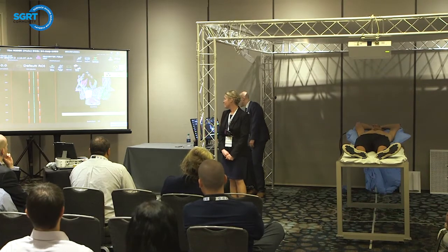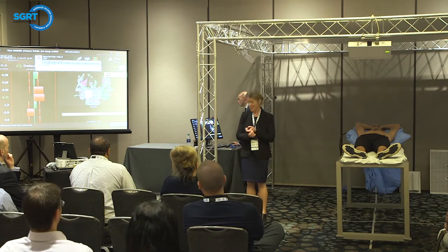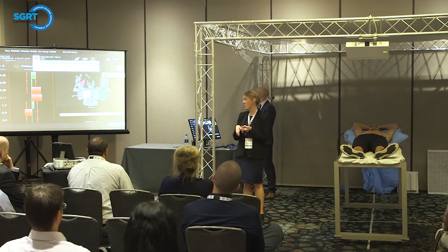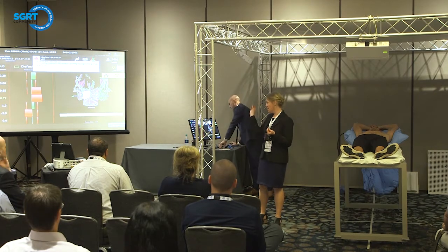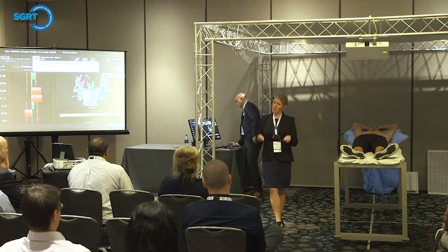I'll see a lot of sites that will do this for the 3-field breast patients. They'll double check the arm and chin position, and also for lung patients. Okay, so now that we're going to be in perfect alignment here, it's time for us to add our bolus. A little bit different in record mode, we need to add a new field just called a bolus field. And that's just going to be a placeholder for every reference that we take when the bolus is on the patient.